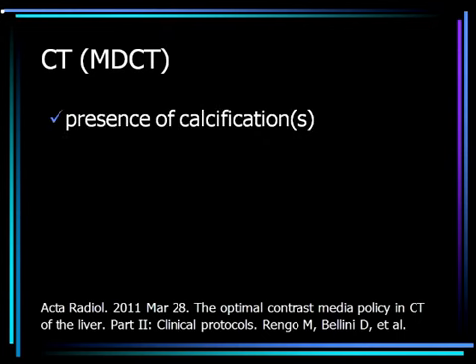What about CT? First of all, that's the technique to see the calcifications, because you don't see them by MRI.